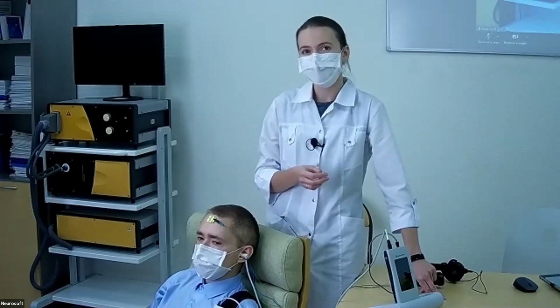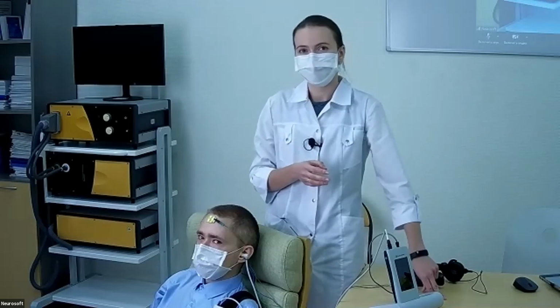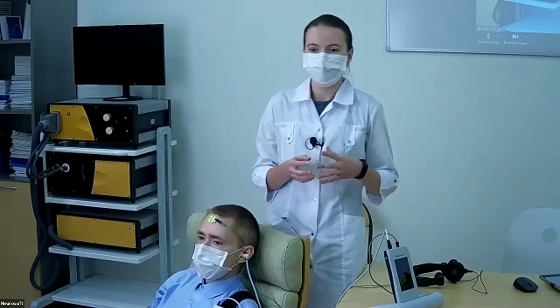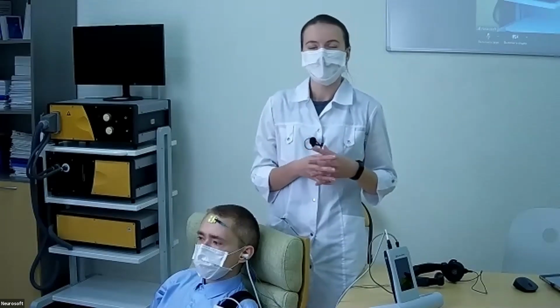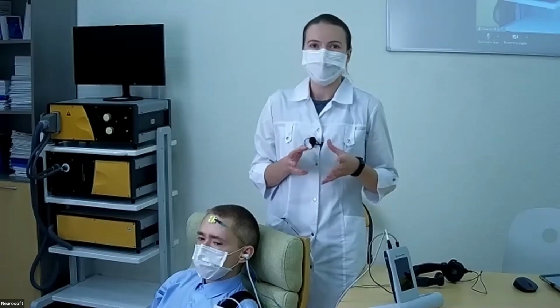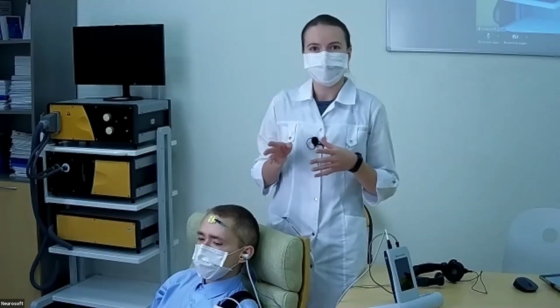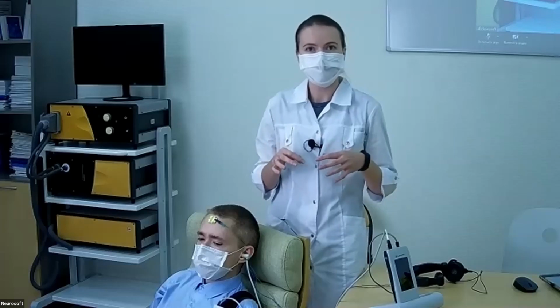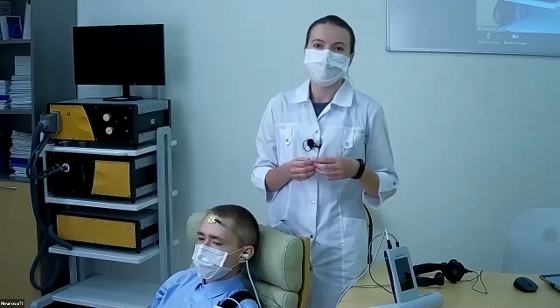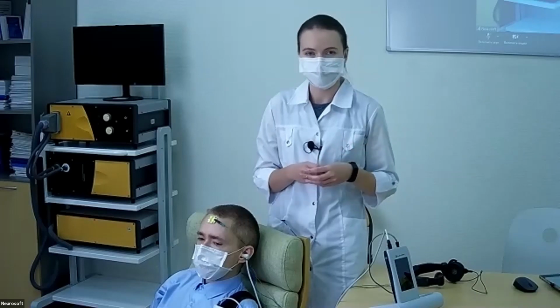And after that, you will know what to do with this patient. You can say that this patient must go for more deep diagnostics with the ABR, for example, using a diagnostic device like the Neuro Audio we used yesterday.